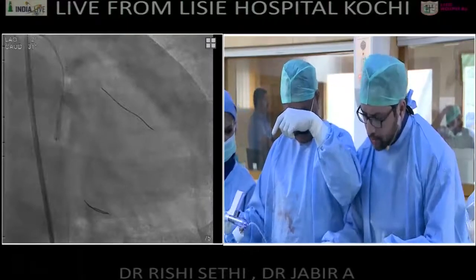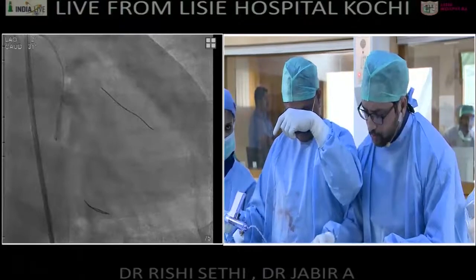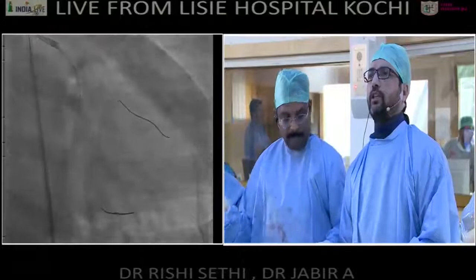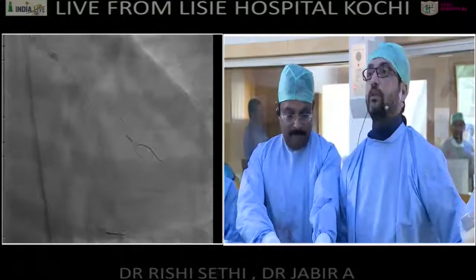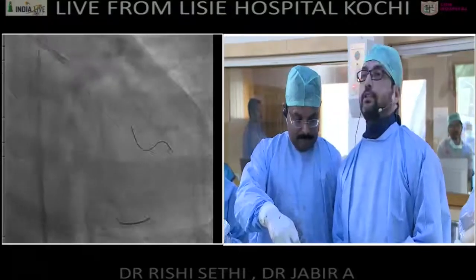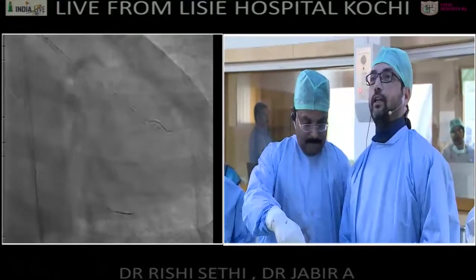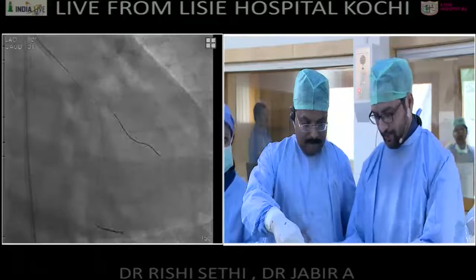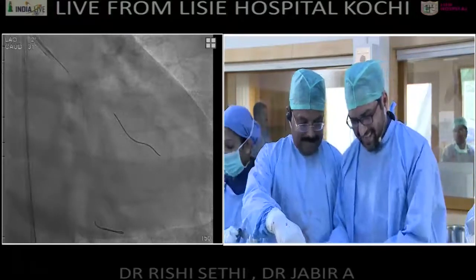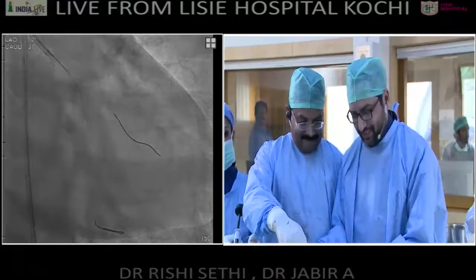I agree that the decision to do this is not so black and white. That's why we were all discussing, but clearly there were two opinions from the lab and in the hall also. So, I guess you can't blame me. No, you're not blamed at all. Just do an FFR again and let's see what happens. Yeah, we will do that, sir.